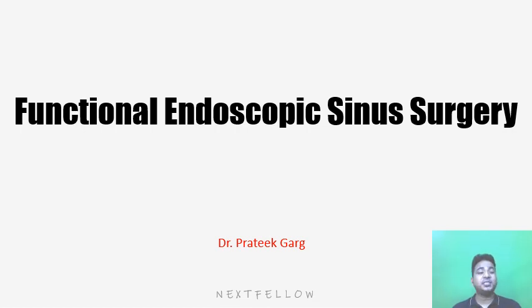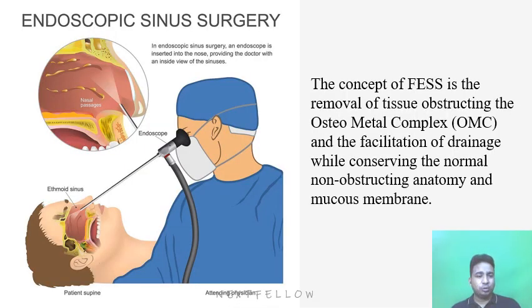So our next topic is functional endoscopic sinus surgery, also known as FESS. Very common surgery nowadays after the introduction of endoscopes. So look at the picture of how this FESS is being performed. What we use is an endoscope.